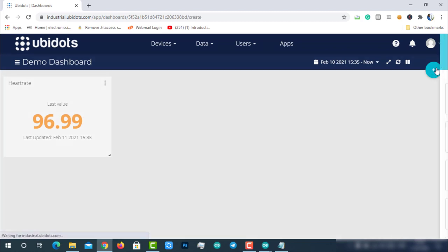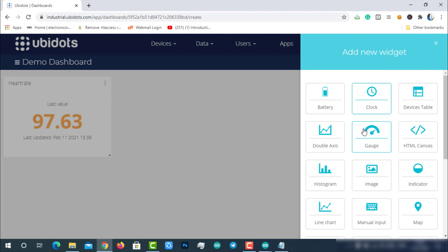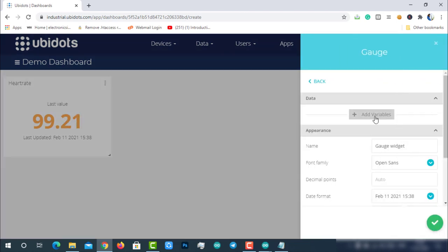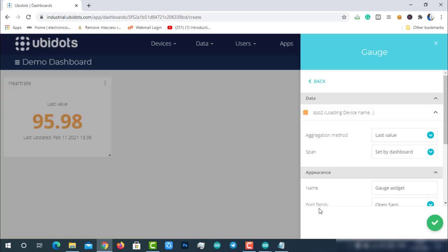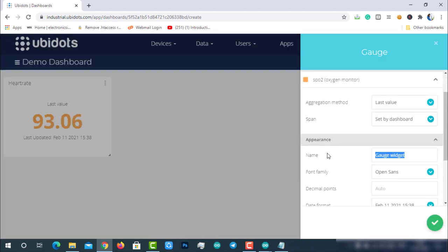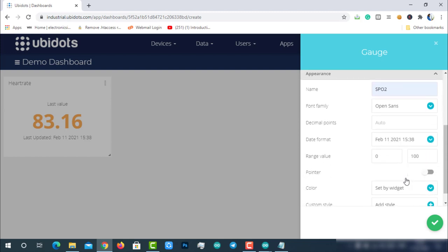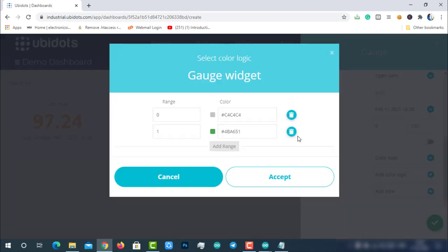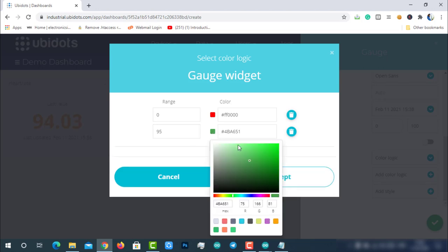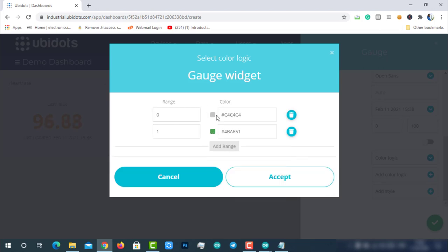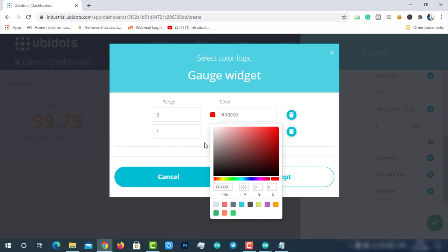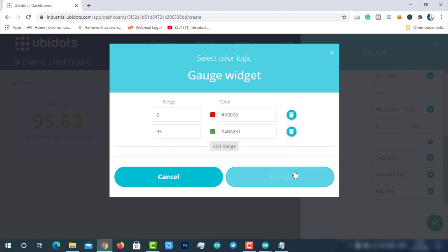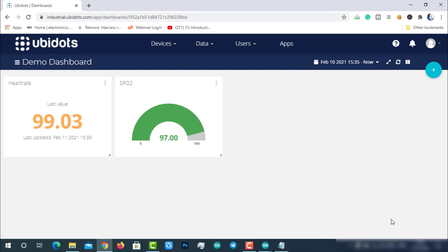Now let's repeat the same process for SpO2. For SpO2, I would like to choose the gauge option to visualize it. For SpO2, I would like to add color logic to differentiate the safe or critical blood oxygen levels. If the blood oxygen levels are 95% or above, they are safe. If below 95%, they are critical. So I will select green color if the oxygen levels are greater than 95% and red color if the oxygen levels are less than 95%. Then click accept. After creating, you can see the live data in green color on the gauge because it is greater than 95%. If that value is less than 95%, you can see that in red color.